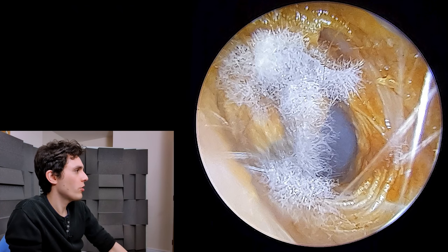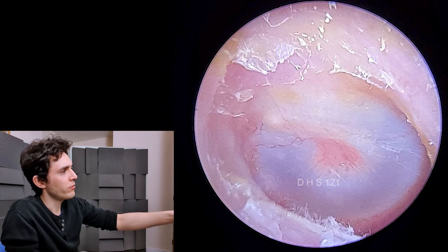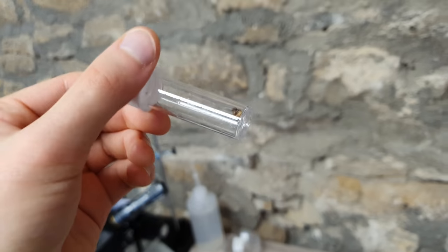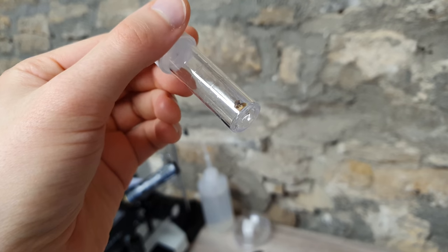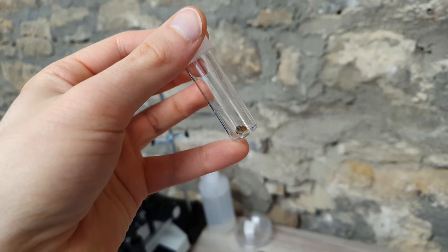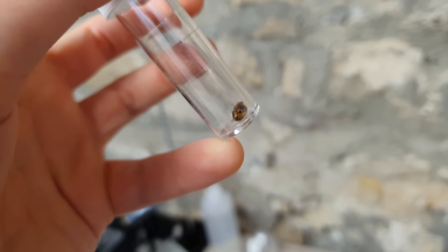So that's a very interesting area of science and it just goes to show how complex and vital fungi is to the world. There's the before shot — again, very well developed fungi, but no spores. And there's the after — lovely looking eardrum there, that kind of purpley blue membrane. This is the tube I decided to just jam it into. I shot this video last week and I've had a look at it a few times under the microscope, and the mycelium is still developing and eating away at the dead skin and wax. If it does transform into anything recognizable, I will certainly post an update.